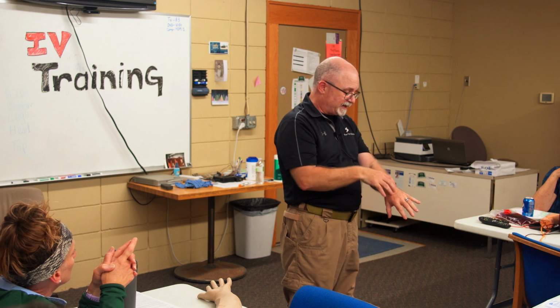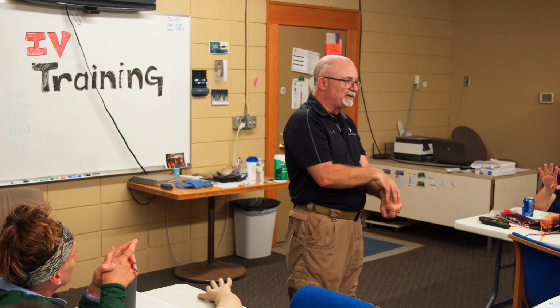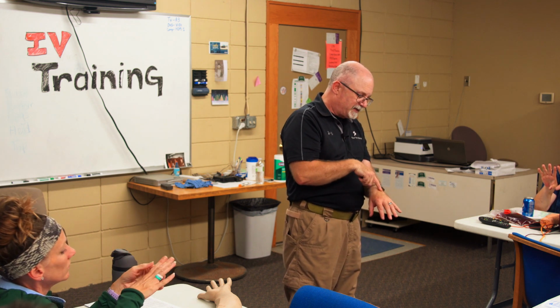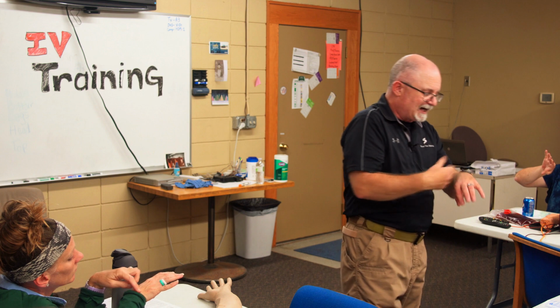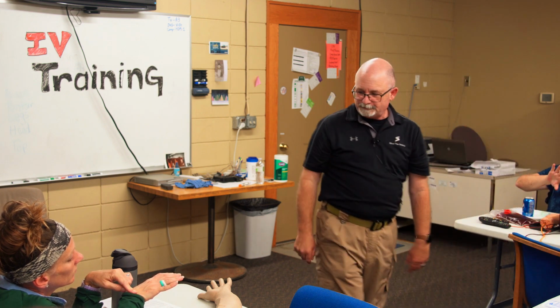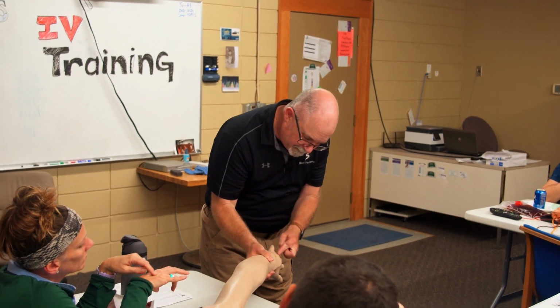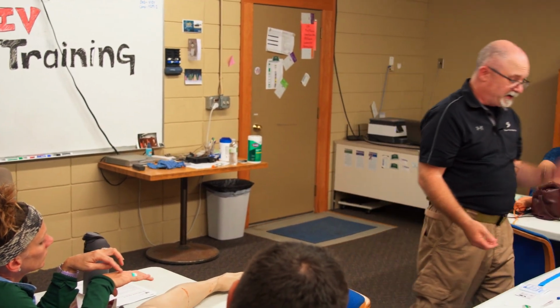My favorite routine IV spot, so you can look at a lot of different anatomy, but on the back of the hand, sometimes you got these nice little tendons running through, they can throw you off, but usually someplace between the ring finger and the pinky over on that side, there's one that kind of bifurcates right there. I like going right straight up because it doesn't wiggle on me. So I don't remember if that one's kind of right in here. But whatever one shows up is going to be your bet.